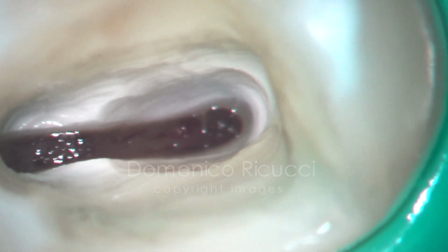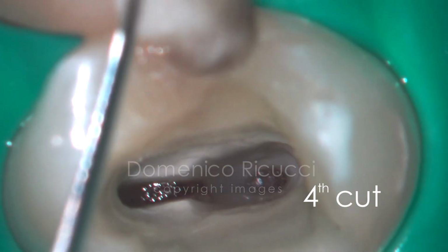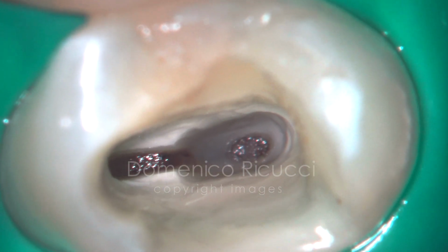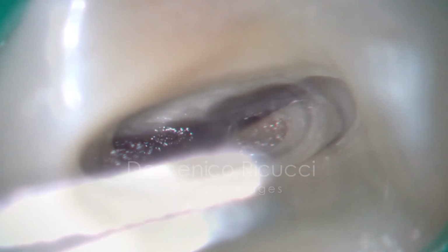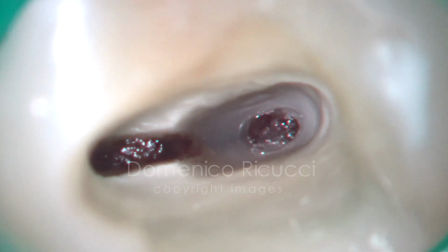On the palatal side, probing reveals that the pulp tissue is still detached from the wall. A new layer of pulp is removed from the palatal side. The resulting wound, brought more apically on the palatal side, appears now regular. The pulp tissue is homogeneous.